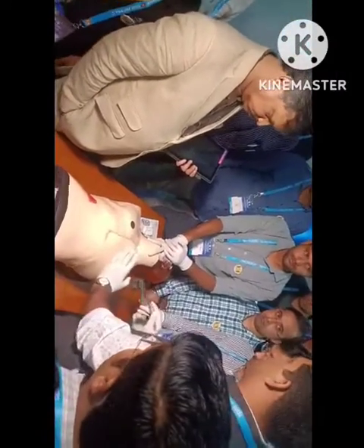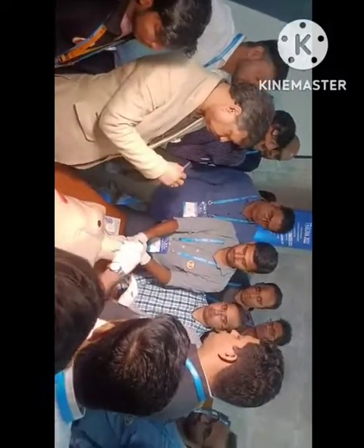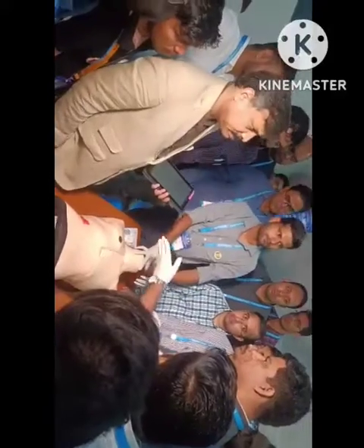I will go in the fourth intercostal space. The rough identification of that space is below the nipple. You don't go and count all. If it is the fifth intercostal space, you go by default. Usually go under the nipple line, in both male and female. In female you have to lift up the breast and go at the base of the inframammary fold. So from where will you start your incision?